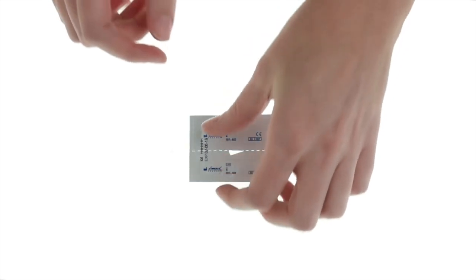To start, remove one single-use sensor from its packaging. Tear along the dotted line to separate one of the attached wrapped sensors.